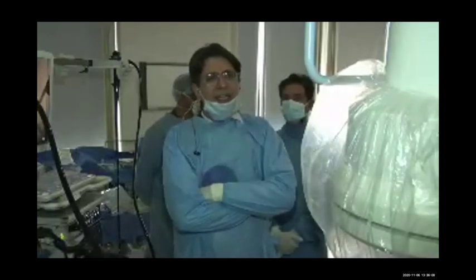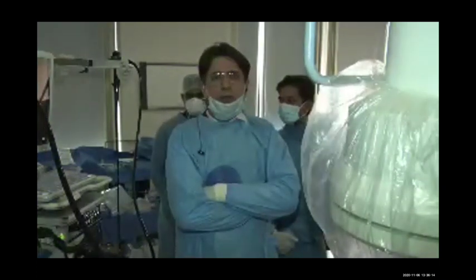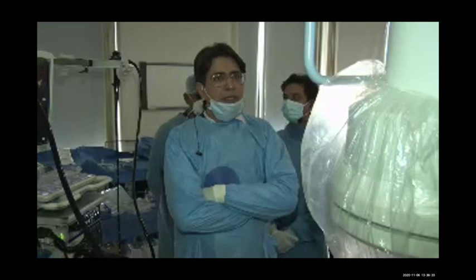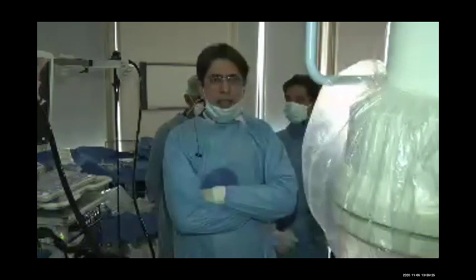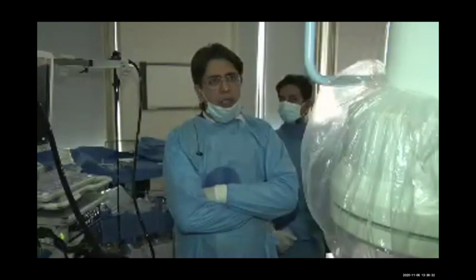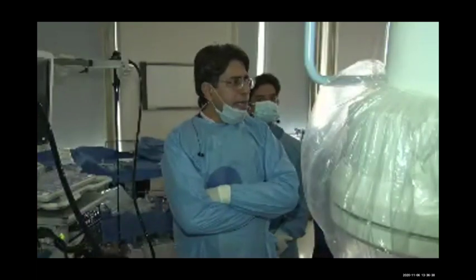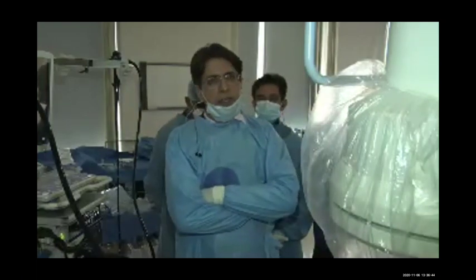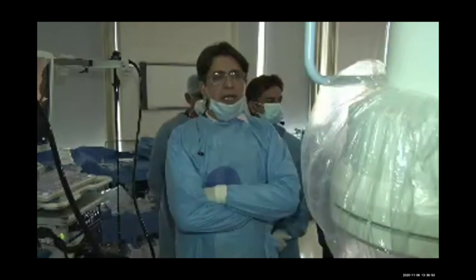And for such a large varix, the total cost in this patient is 12,000 rupees for the coil, maybe 4,000 to 5,000 rupees for the glue, and the injection and the needle. Even if we count the needle cost of around 14,000, the entire job is 30,000 to 40,000 rupees. If I had done BRTO, it would have cost 3 to 3.5 lakh rupees in my hospital. So the complete charge of this procedure, including fluoroscopy, coil and glue, and the therapeutic intervention in EUS, is not more than 50,000. And we have ensured complete obliteration of the varix under EUS also.